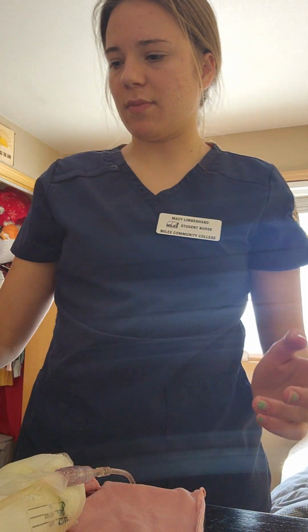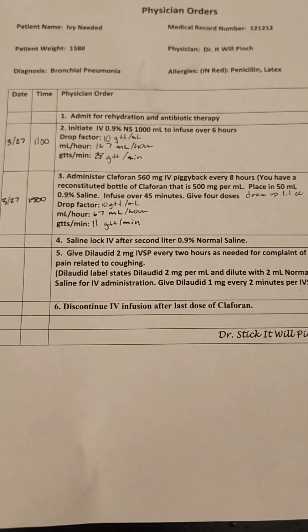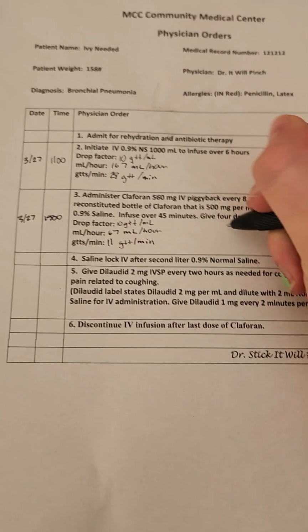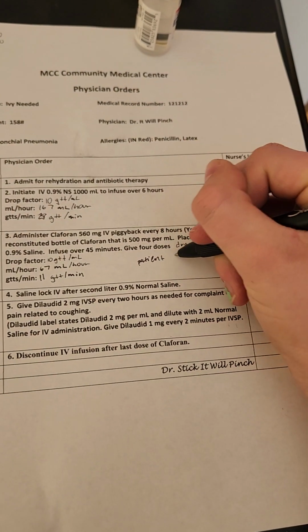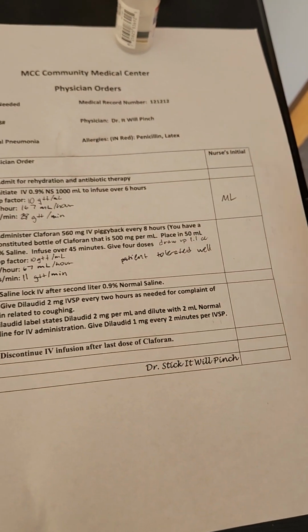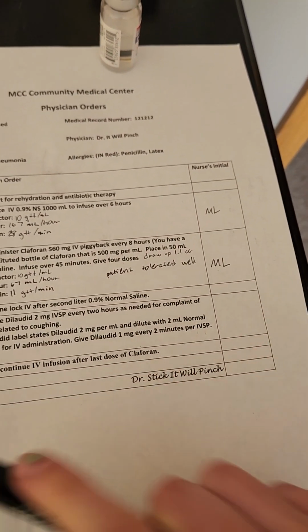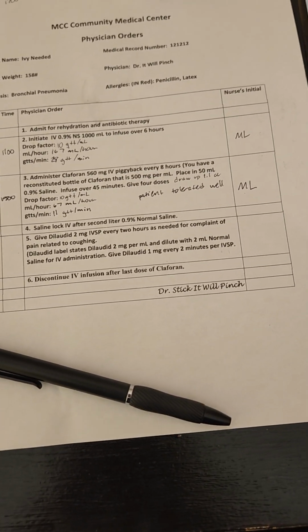One thing I did forget to mention is I would document everything that I just performed on my MAR. So, I have this, and I would make note. I would say patient tolerated well. And then sign it. If there was anything that went wrong, I would make a note of that and then sign it.